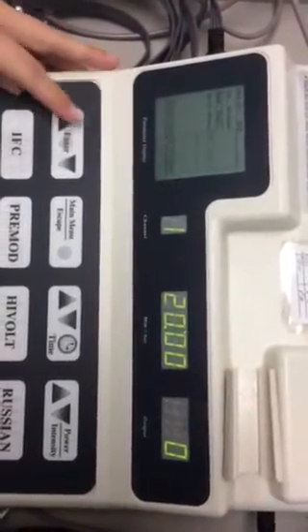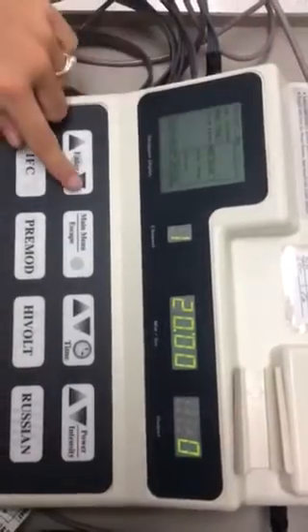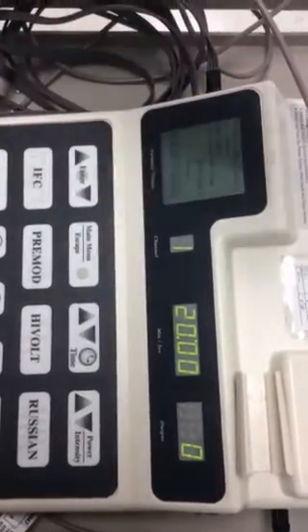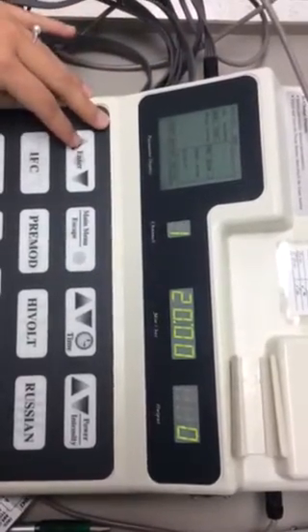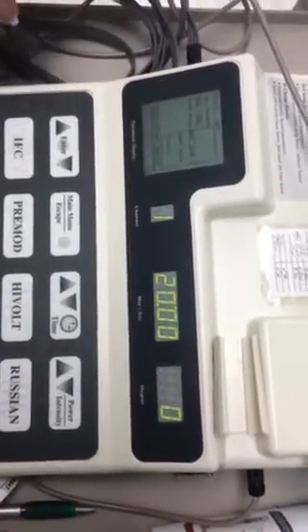Amplitude you can change. That just means if you set the beat frequency to 100, 40%, it's going to go down to 60 and back up to 100. If you set it to 100%, it's going to go from 100 all the way down to 0, back up to 100. Static, it'll just statically stay at 100. 40% may be more comfortable for someone who is older and is not used to the buzzing sensation.